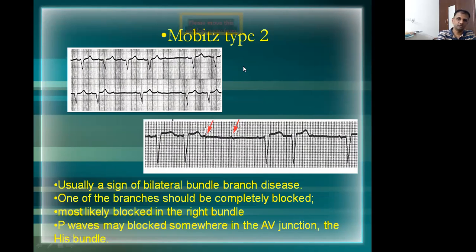Don't worry, it is all a bit confusing, but the more you look at the ECG, the more you practice, like mathematics, you'll get it. I just wanted to briefly go through these things so you'll know what these types are, so that when somebody asks you what Mobitz is, you'll be able to answer.